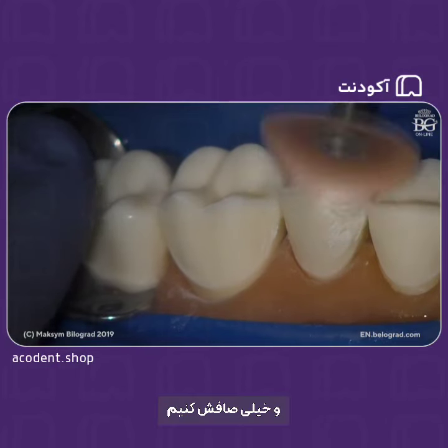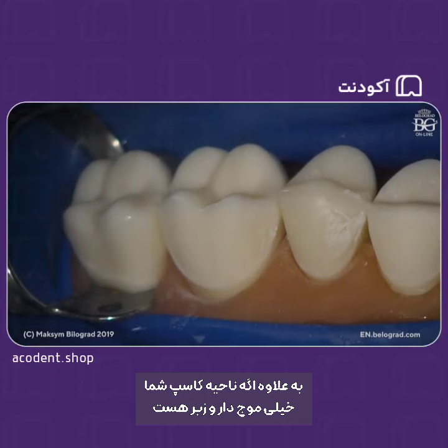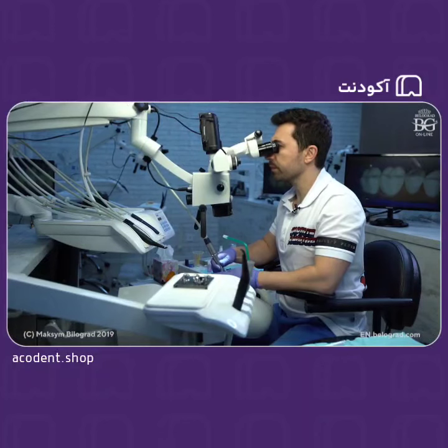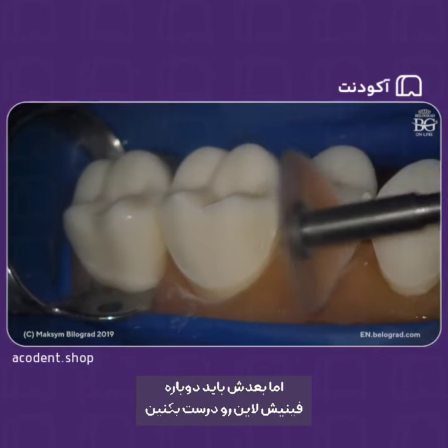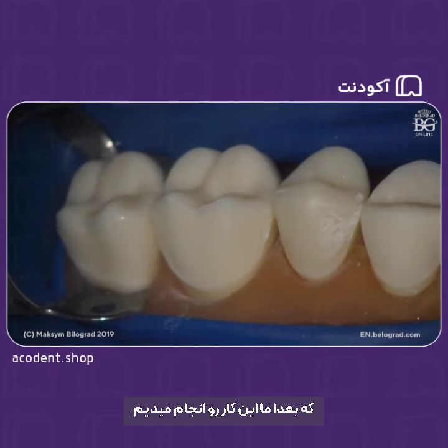We can make it really smooth. Also, for example, if your cusp area is too wavy or rough, you can make it more straight with disc. Okay, but afterwards you would have to refine the finish line. Okay, but we will do it later on.